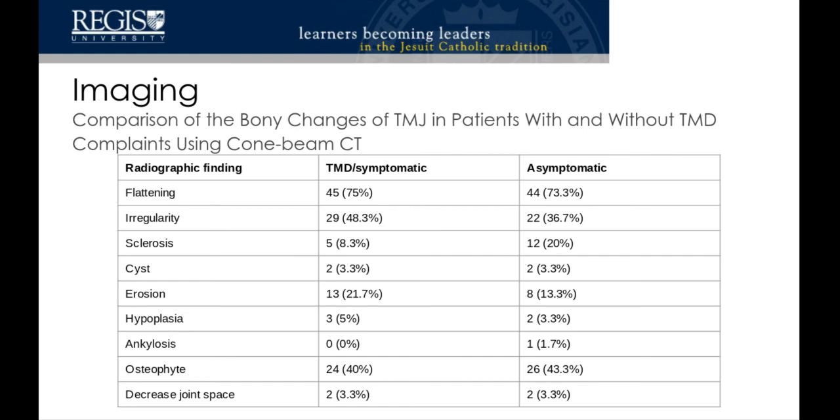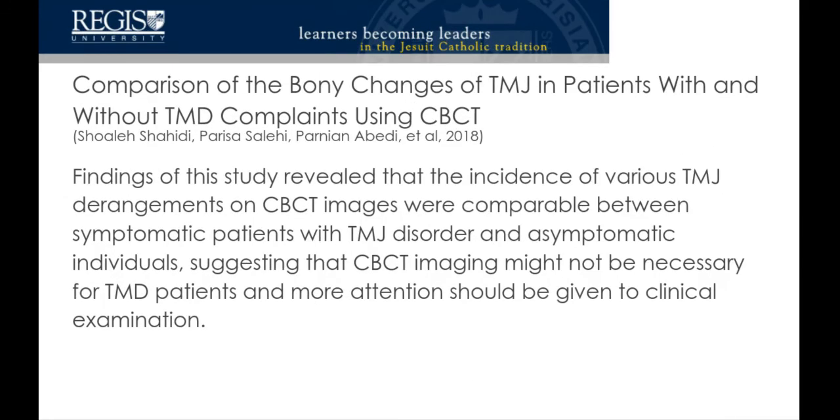You can have flattening of the condyle, you could have sclerosis, you could have little cysts, you could have bone spurs. All these things happen, and lots of people have them and never have any symptoms. So this is just another case of you treat the patient, not the CT scan. This is just a summary slide of what I was just saying, that all of these findings were comparable between the groups, and this type of scan may not be necessary for TMD patients, and the clinical exam and the person in front of you should be what you treat.